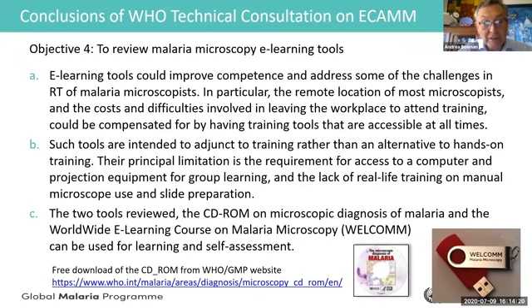Also, what we did, this was more than 1 year ago, we reviewed all the e-learning tools that we have for malaria microscopists. And 2 of them we reviewed in more detail. One is a CD-ROM, which is available on the WHO website. You can download it.